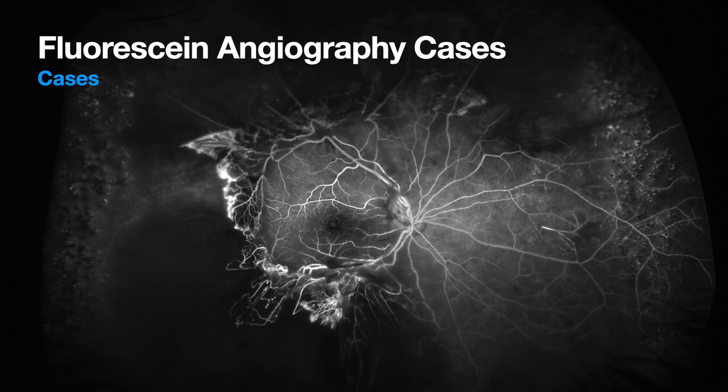The other eye has similar findings but worse — now there's a tractional retinal detachment (TRD). Inferior temporally, it's dark and you can't see detail — that's where the TRD is, kind of kidney-bean shaped. A lot more neovascular complex there, and the patient also had prior laser. This patient clearly needs more laser, and needs surgery in the right eye as well.